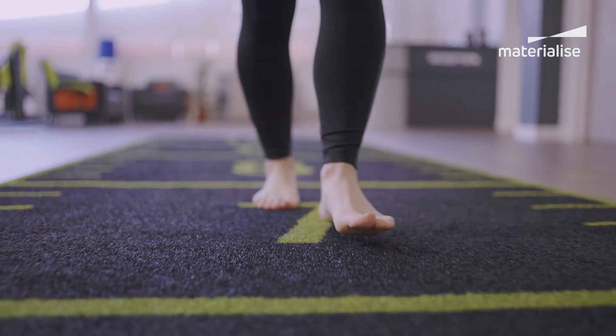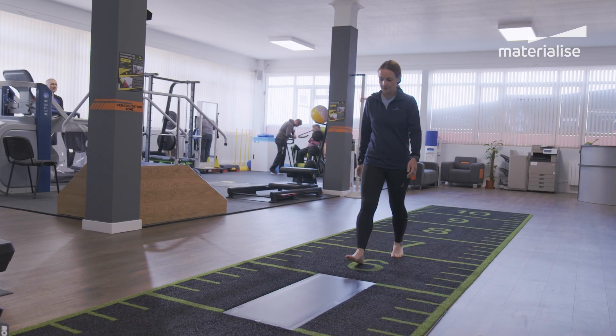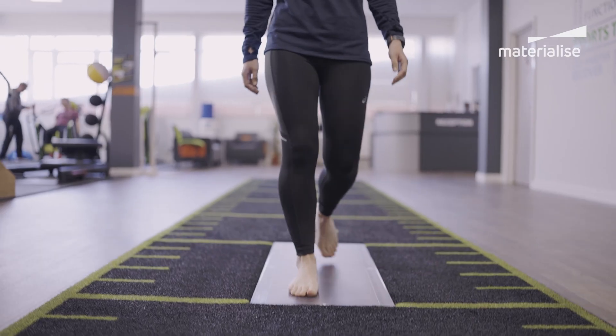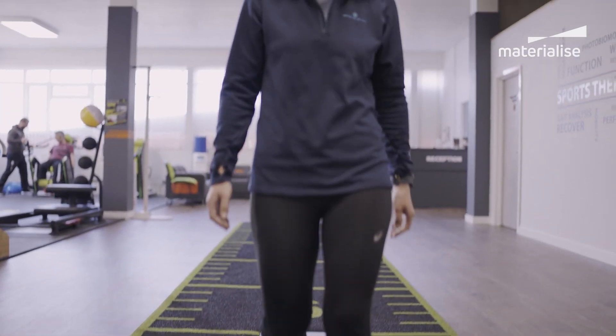With these new features, we're confident that your workflow will be more efficient and your patient care more precise. Upgrade today and experience the difference.